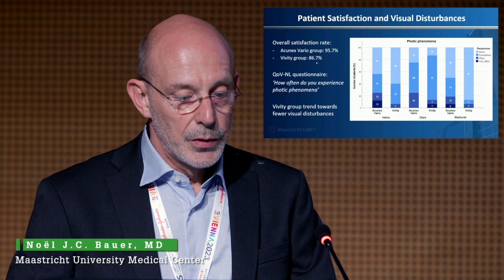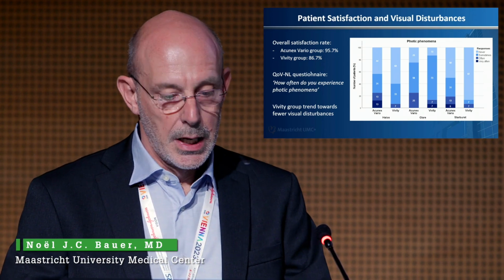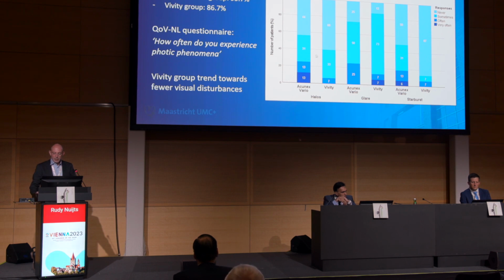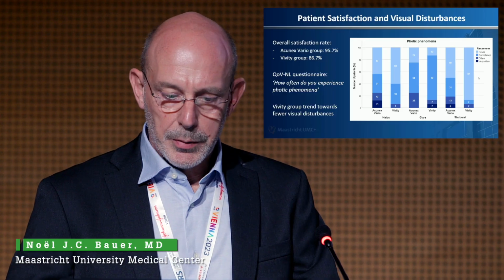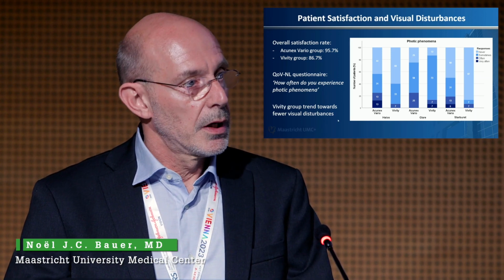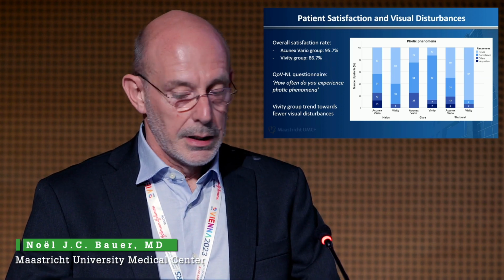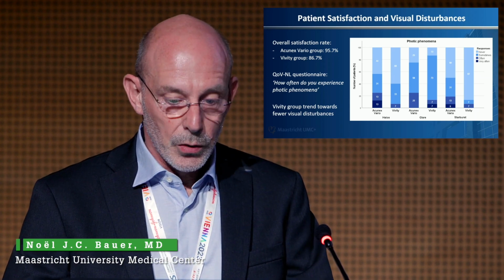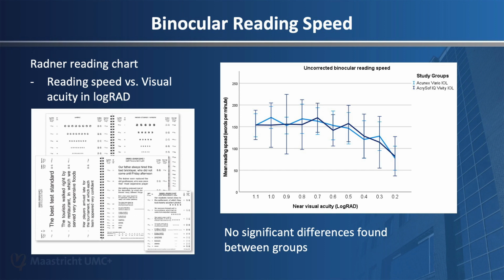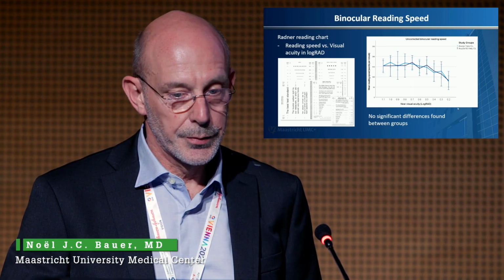So we asked the patients, how often do you experience photic phenomena, like halos and glare and starbursts? Here you see the results of that, which are also comparable, and actually a very small number of people experience these problems. It must be said that we had only 2 patients that had bothersome halos and glare. So although they were there, only in 2 patients they were bothersome. The reading speed is depicted here, which is similar between the 2 groups. No statistically significant differences found.